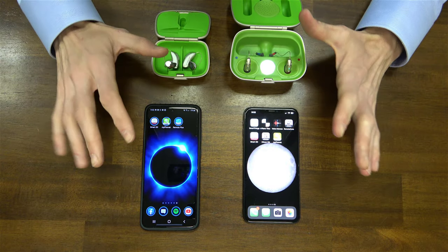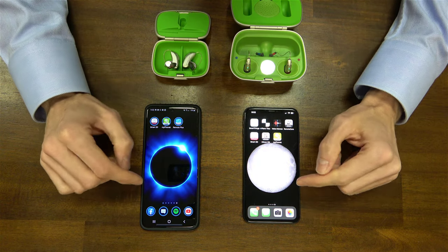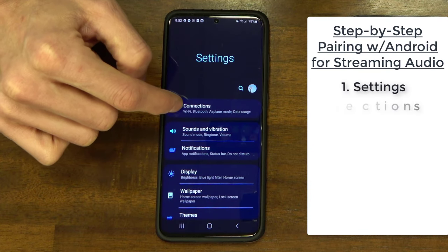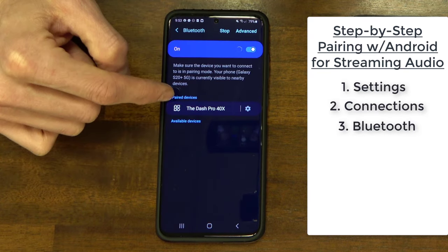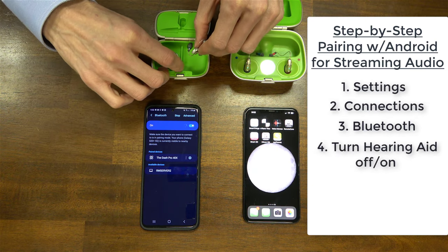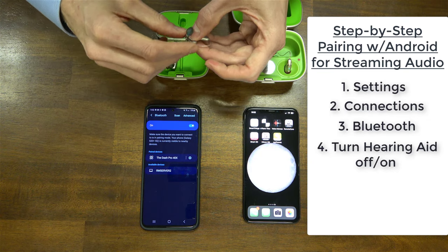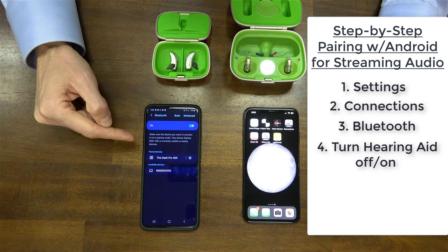Once we have the apps downloaded to the smartphones, there are a couple of different areas we need to pay attention to. In this particular instance, we're going to connect with the Android phone. So I'm going to go back to the home screen, open up the settings window, then go to connections, and make sure that we have Bluetooth turned on. We're going to go into the Bluetooth screen, and then only one of the hearing aids will connect with the phone. We want to make sure that we have the correct main hearing aid pairing with it inside the Bluetooth screen.